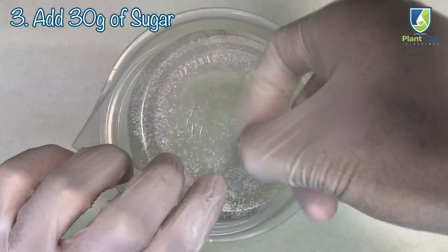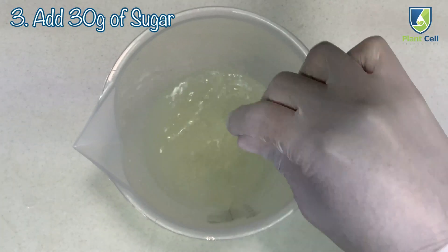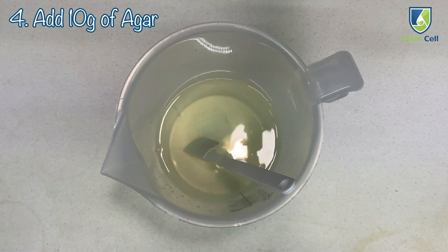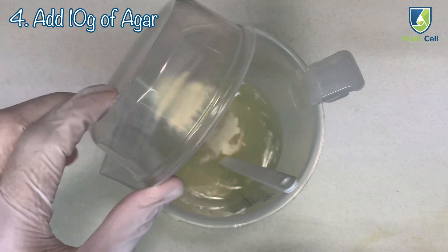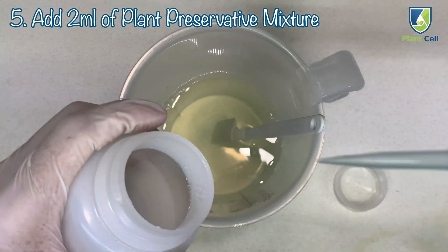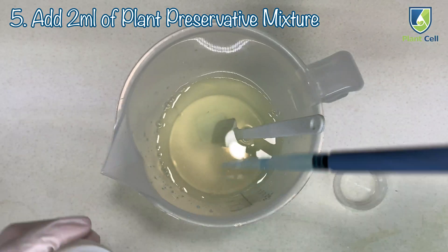Add 30 grams of sugar. Add 10 grams of agar. Add 2 ml of PPM. This is going to help give your plant a great start in life.